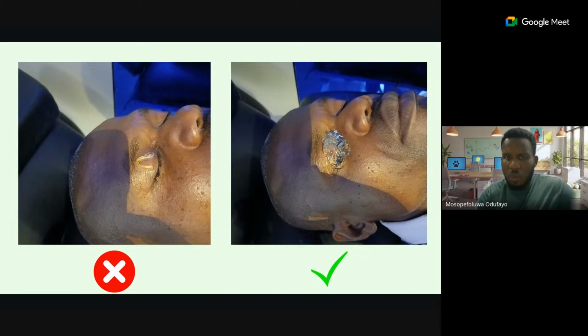You would observe that when we apply copious gel this way, in the right way, when your probe is contacting this gel, it's just supposed to be on the gel alone and it's not supposed to touch the eyelid. So the probe is supposed to just touch the gel, but not mount pressure on the eyelid at all, such that if you're looking at the screen, there is a gel interface before you see the eyelid. That's the ideal way the investigation is supposed to be done.